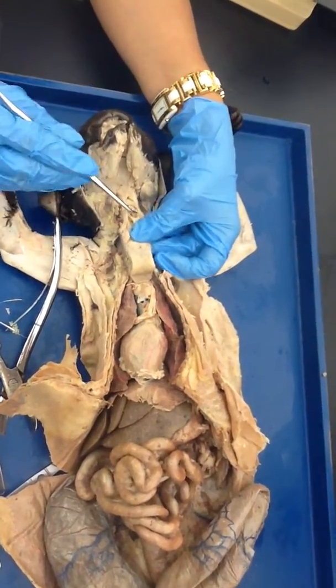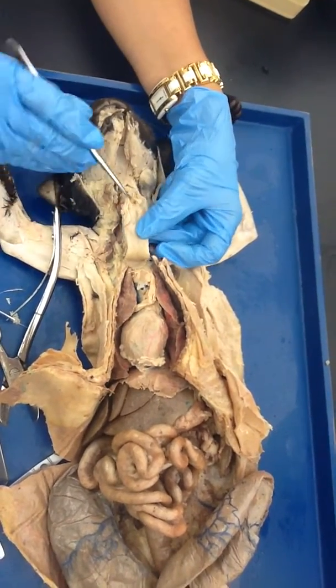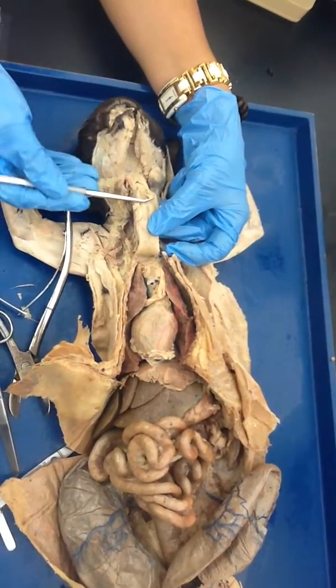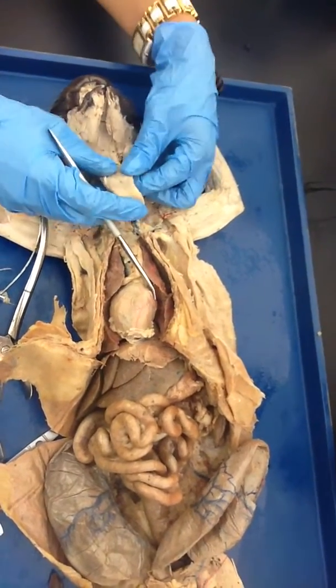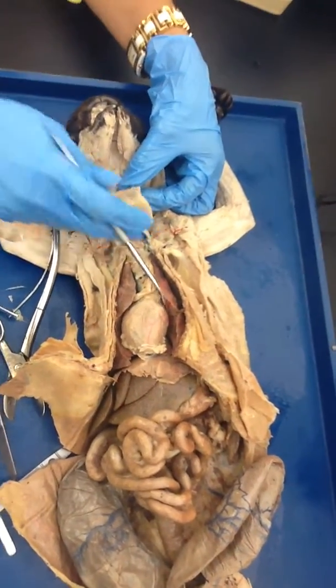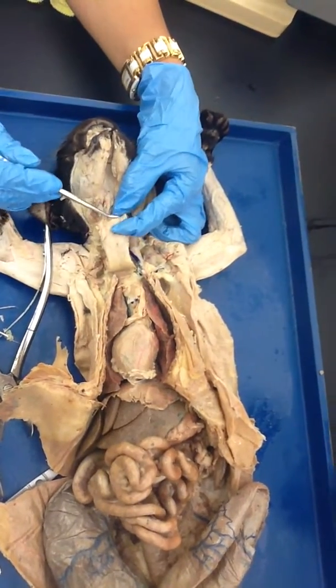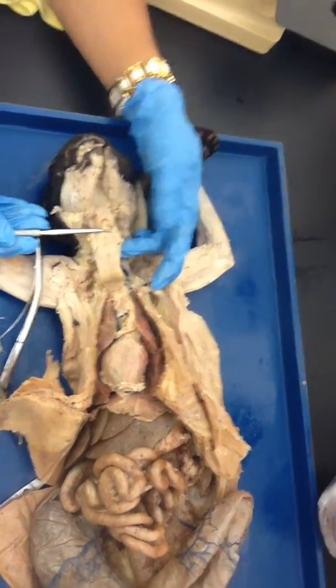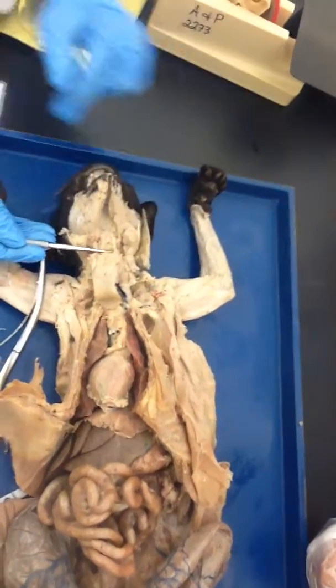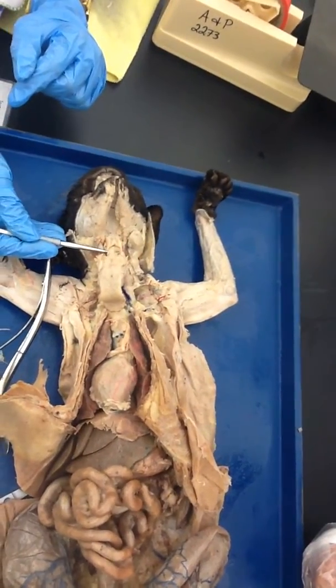Do you see how clear it is over here? This is the epiglottis — so this is the glottis. The epiglottis covers it and kind of secures it. Do you see how it flaps down? When you are eating food, it flaps down here and closes the glottis — do you see how it closes the glottis?